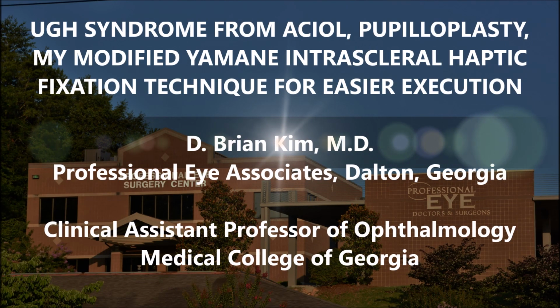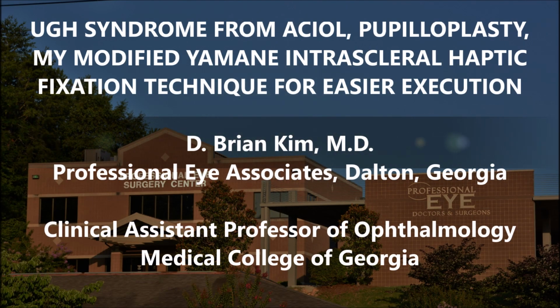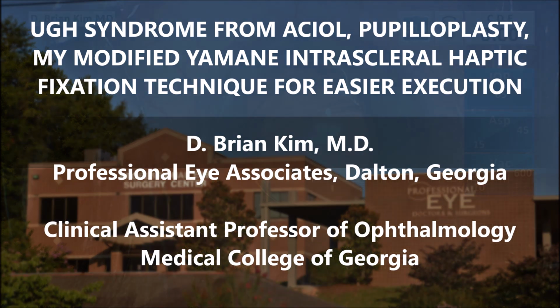I'm going to share with you this case of a patient who was referred to me from out of town. The patient had complicated cataract surgery, and then the wound had to be widened and lens fragments removed, and then an anterior chamber lens was placed. The patient had persistent visual trouble as well as UGH syndrome, it seems like, and persistent cystoid macular edema. There's also some corneal edema, and the pupil is distorted and dilated, likely due to the ACIOL.